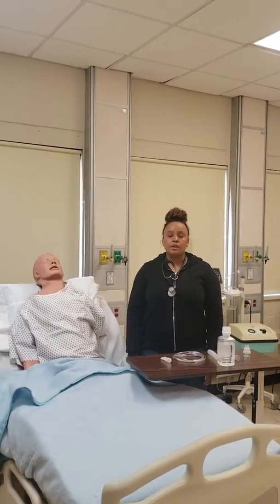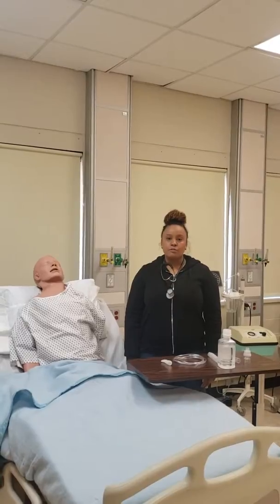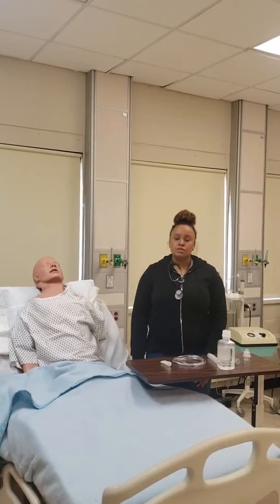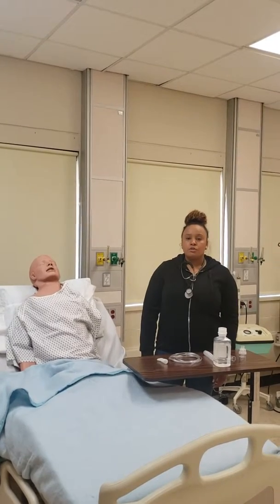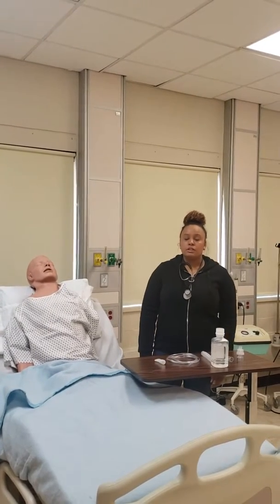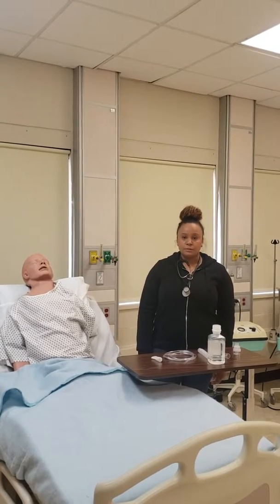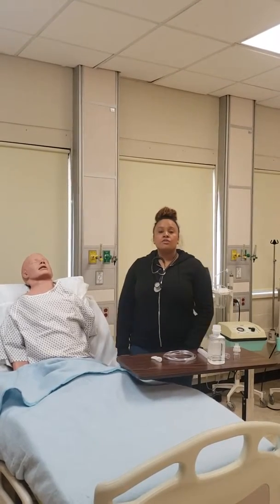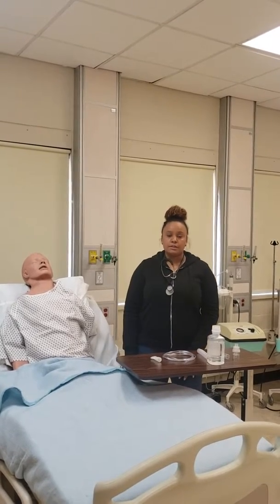Performing the small volume nebulizer treatment. I will first verify the physician's order for the appropriate medication that I will be giving, dosage and frequency, which will be 2.5 milligrams of albuterol into 3 milliliters of normal saline solution every 4 hours. I would also review the patient's chart for any significant findings, such as allergies.